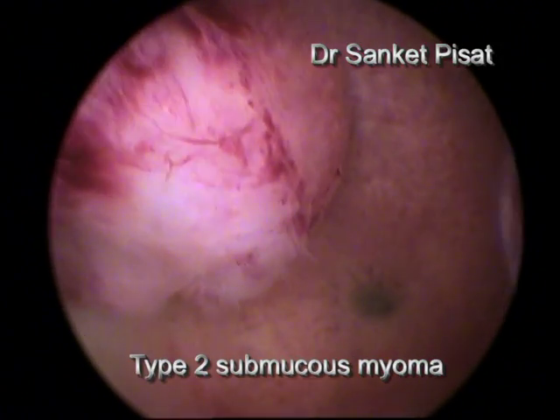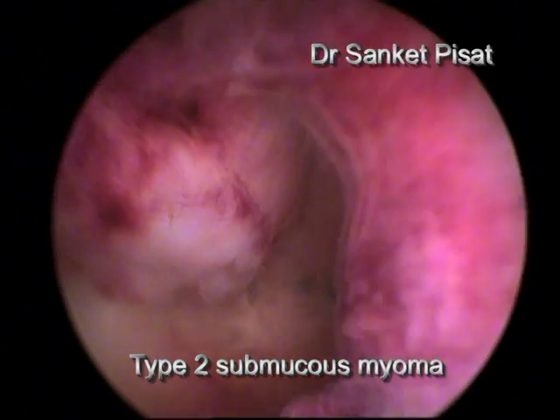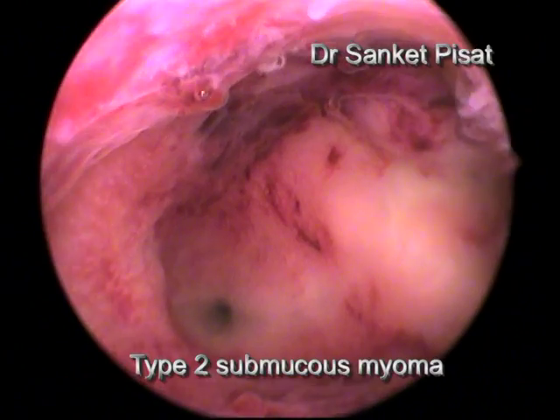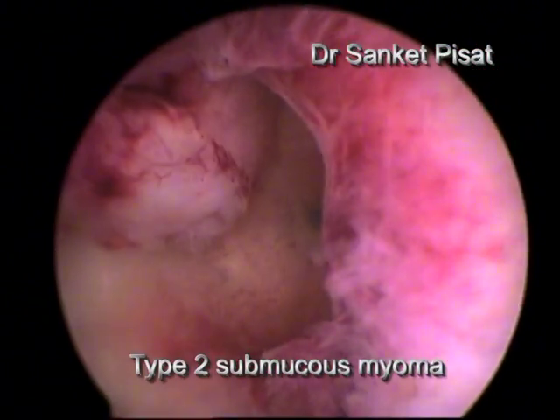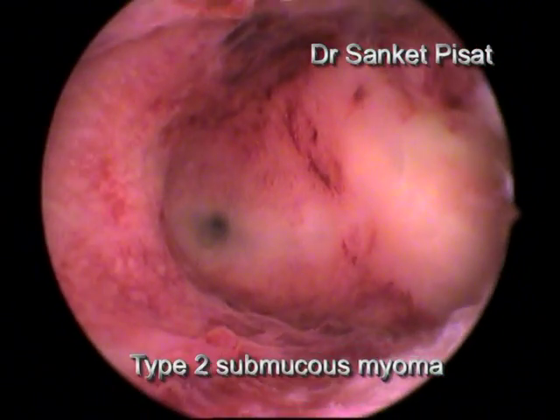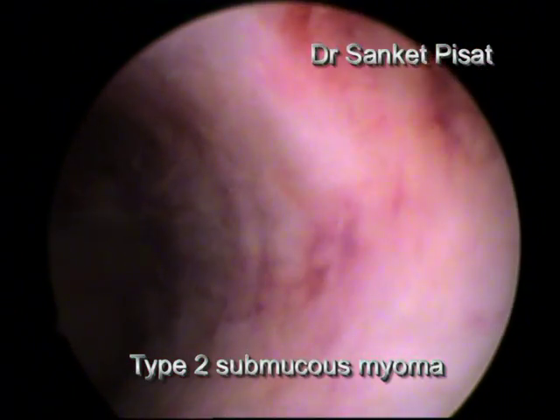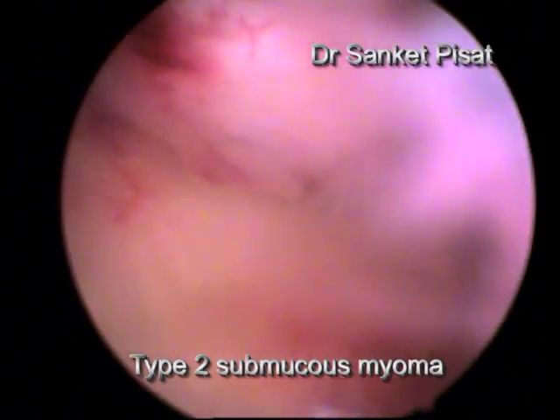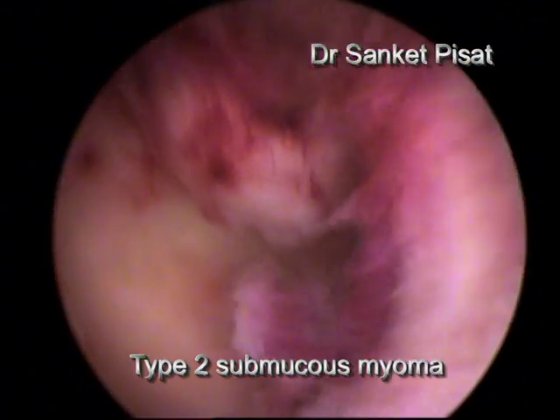This is a patient with a type 2 submucous myoma, partly projecting into the uterine cavity and partly located within the uterine wall. A cursory examination of the rest of the uterine cavity shows that the uterine cavity is normal with no other apparent pathology.